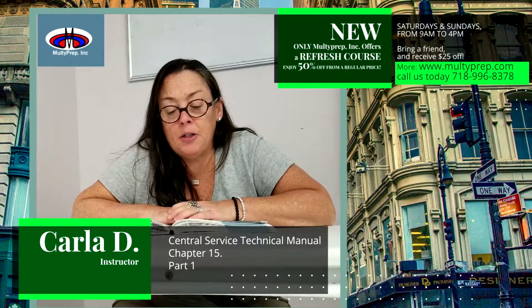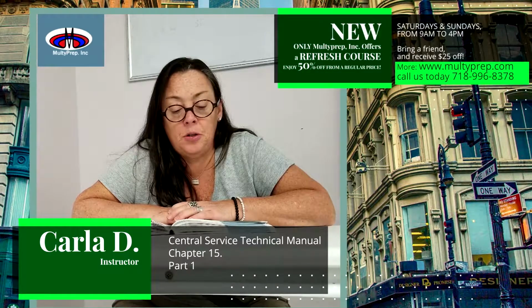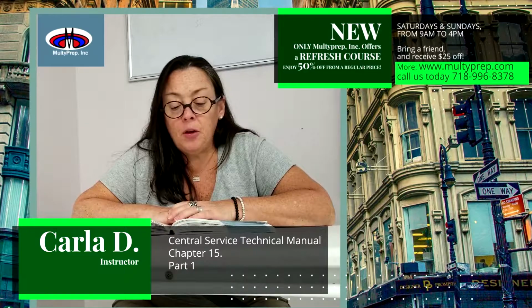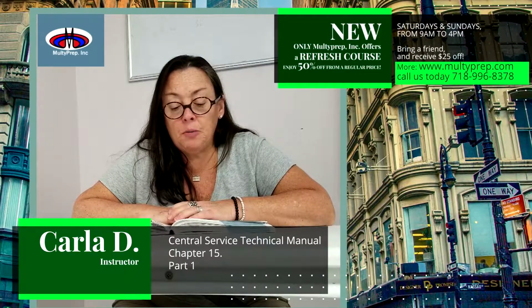Material compatibility. There should be no changes in the device's functionality after sterilization. Adaptability. Should be compatible with or easily modified to meet existing healthcare practices. And finally, approval. Must be cleared by or registered with the appropriate regulatory agencies. To be effective in the healthcare environment, a sterilization system must satisfy all requirements. Failure to meet even one requirement may pose a significant risk to patients and healthcare workers.